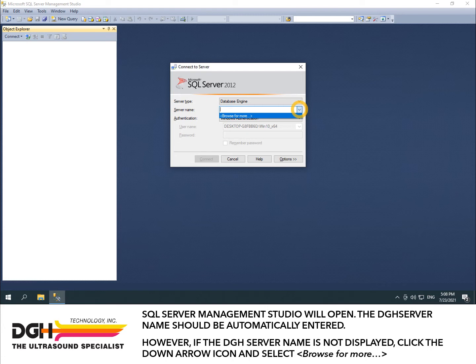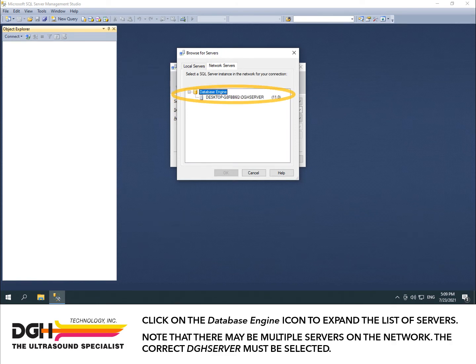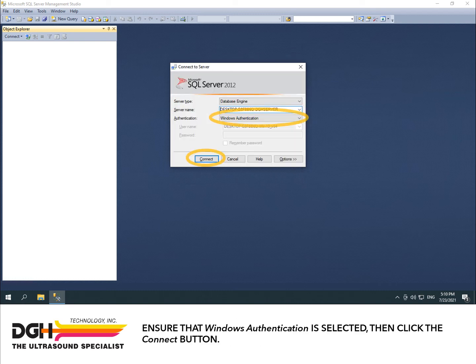However, if the DGH server name is not displayed, click the down arrow icon and select Browse for More. A Browse for Servers window will open. Click on the Network Servers tab. Click on the Database Engine icon to expand the list of servers. Note that there may be multiple servers on the network. The correct DGH server must be selected. Ensure that Windows Authentication is selected, then click the Connect button.